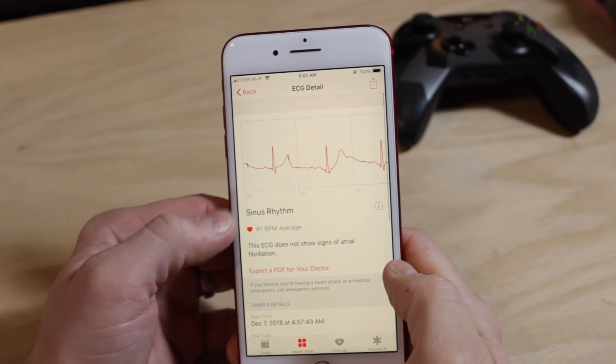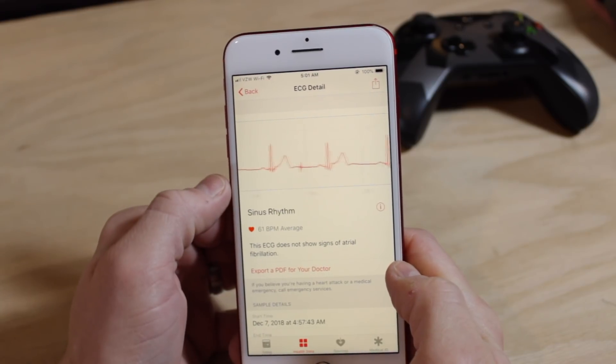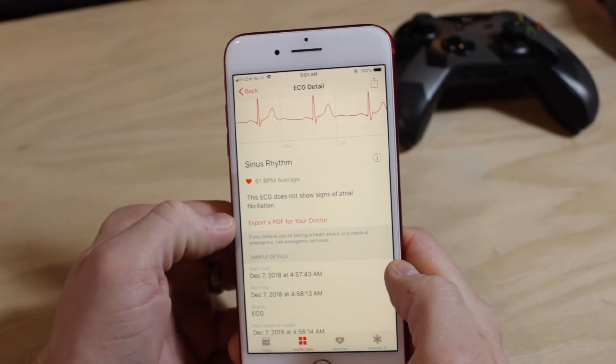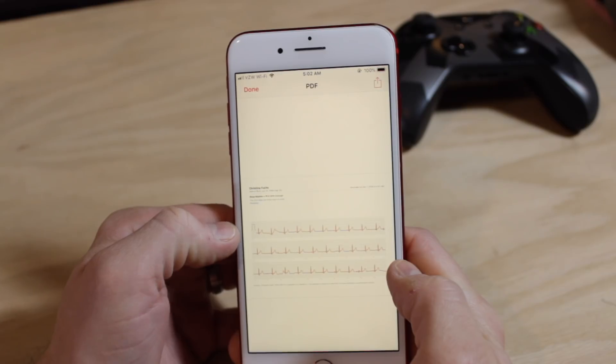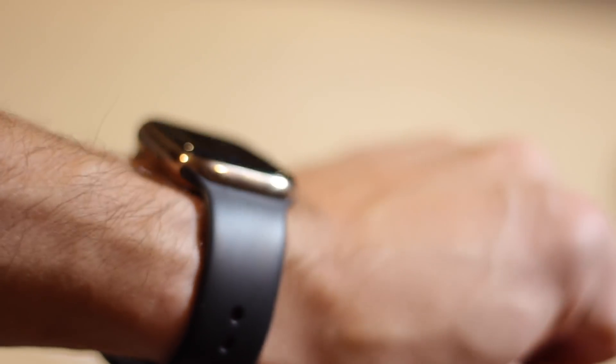If you're curious to see your results or want to share them with a medical professional, head back to the Health app on your iPhone to get all the details. There you can see your heart rate, the readout of the ECG, the date and time of the test, the device used, and an option to export it as a PDF which could then be sent to your doctor for further analysis.